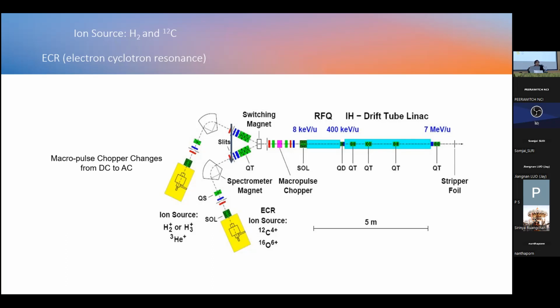The more particles you can inject at the higher energy, there's this thing called your emittance and your acceptance. Your LINAC here is going to emit something, and then your accelerator, your synchrotron, has to accept something. These two things have to be matched up as well as possible, so you can get the most particles into that synchrotron. The more particles you have in the synchrotron that you can then accelerate, the more you could use to treat the patient, which means the amount of time it takes to treat the patient is less. And the more time one patient spends at the table, the less time another patient can be treated.